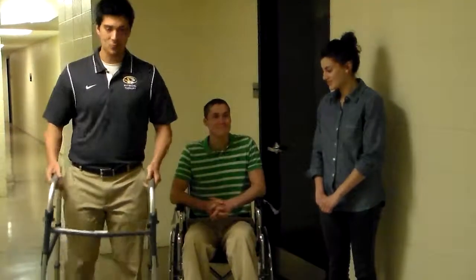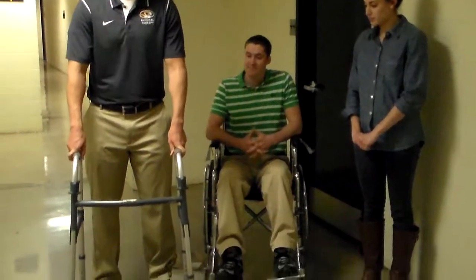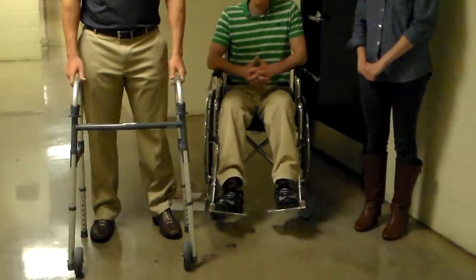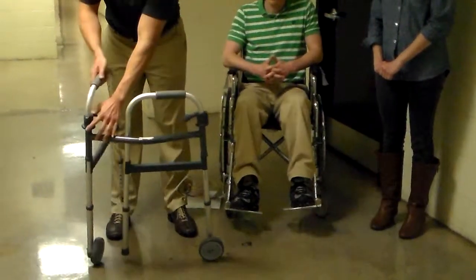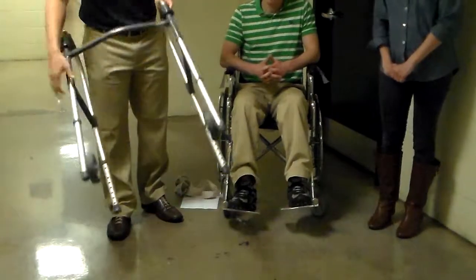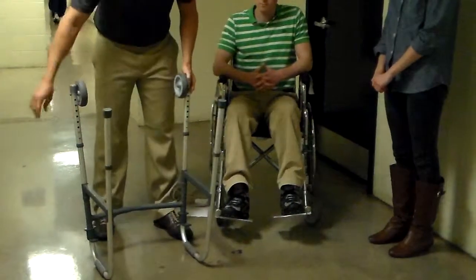So this is a walker. This is an ambulation aid that provides anterior-posterior stability along with lateral stability. To use a walker, you can fold it like such, fold it out. You can also adjust the walker's legs depending on the height of the patient.